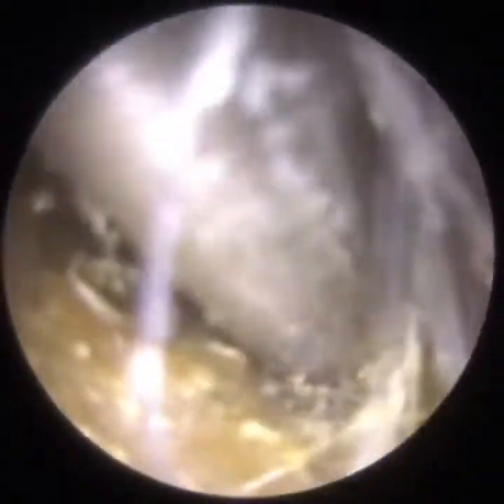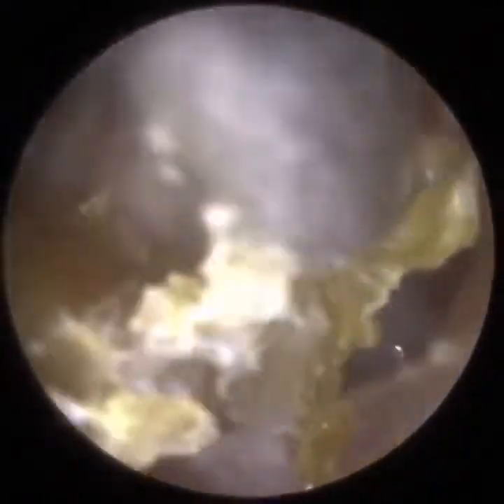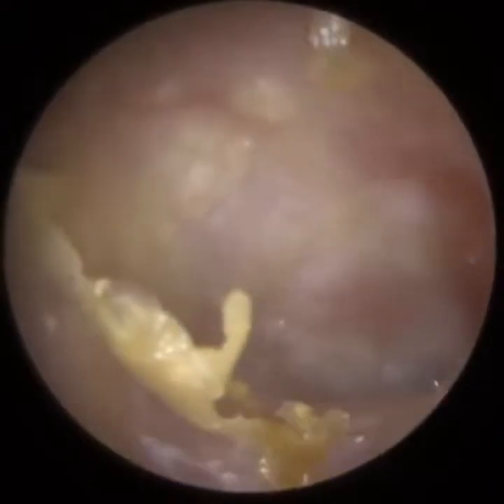And that creates two trenches, two recesses: an inferior recess, a basin near the eardrum, and also one anteriorly, to the front part of the eardrum, so in this case on the left-hand side of the ear. So I'll just come back to that in a moment. Again, there's some sticky wet skin on the anterior canal wall.